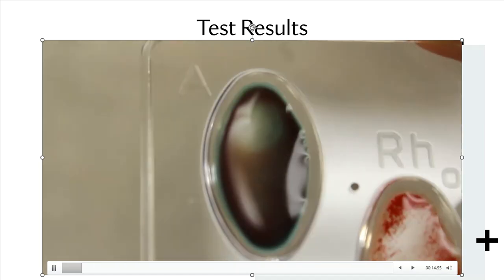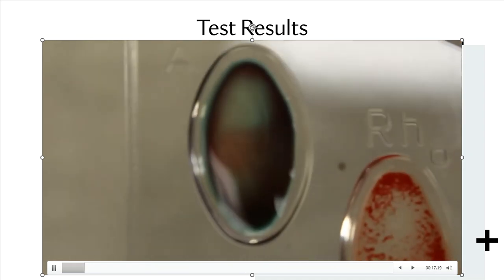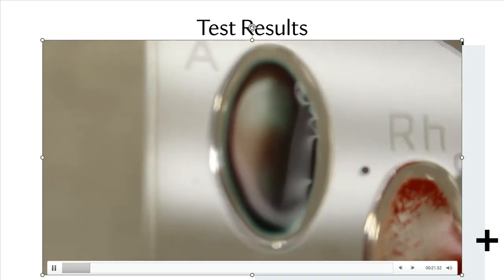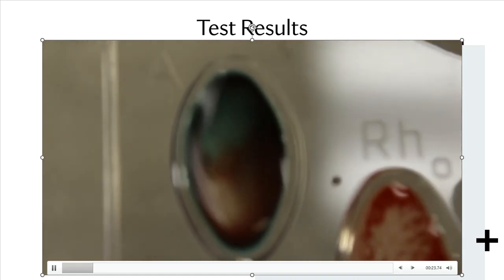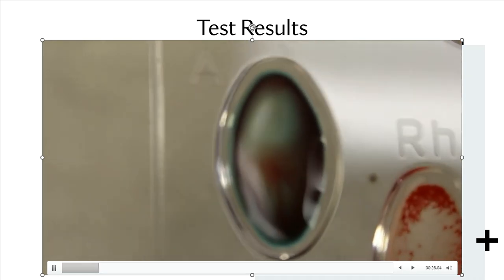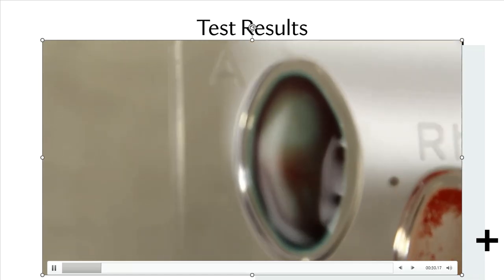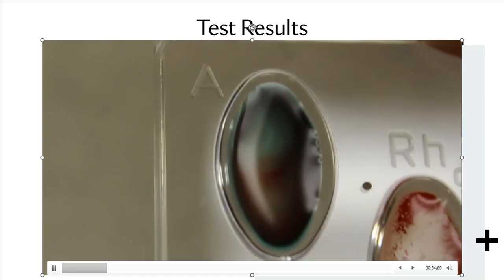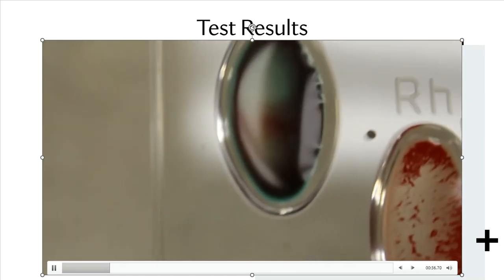And if I begin to rock it back and forth, you're going to see a very liquidy solution, right? I mean, nothing is agglutinating, nothing is clumping. I don't see any kind of spots here that are trying to separate or precipitate. They don't really precipitate, but at least clump together. I don't really see that at all. So what this means is probably not blood type A.